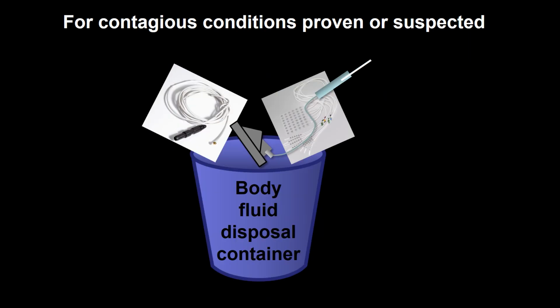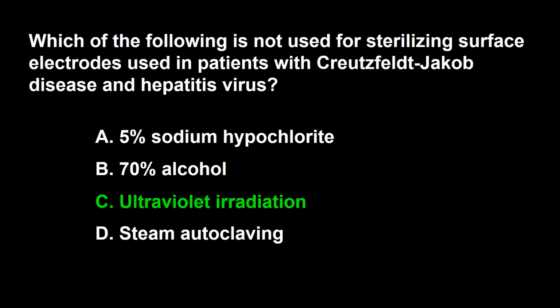Remember, if in the answers you find an option that is disposing of the electrode, then that would be the correct answer for all surface and non-surface EEG recording, regardless of the status of the patient. So the answer to this question is C.